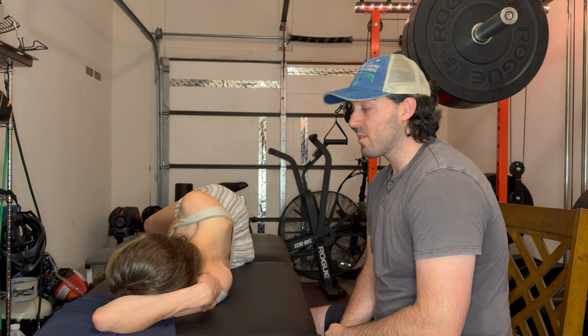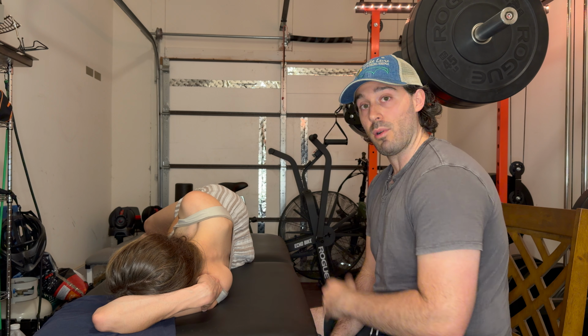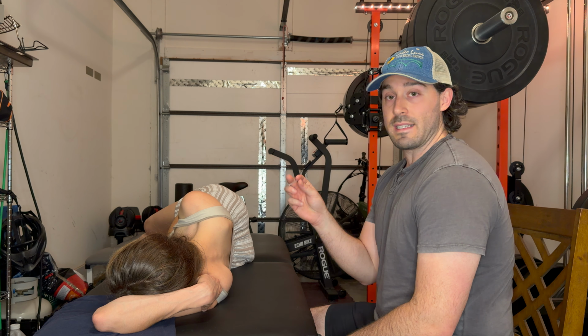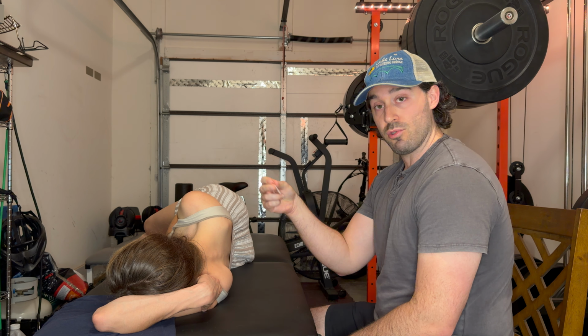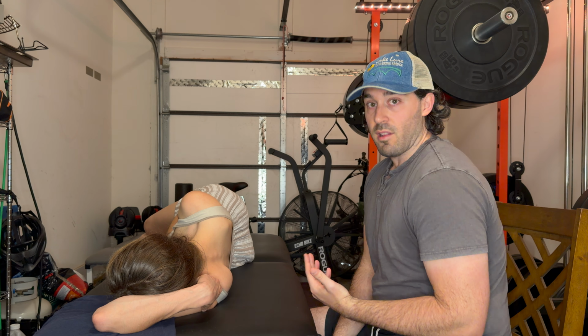With the levator scapula, I really like to needle it one of two ways. The first way, and my most favorite way, is actually doing it sideline, like we have my patient here right now. I'm mostly just going to use a guide tube to show the fiber orientation, the needle direction that we would needle in.